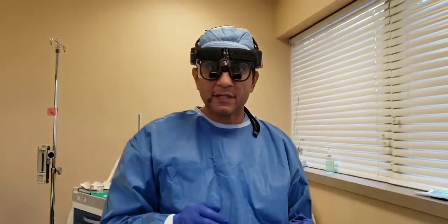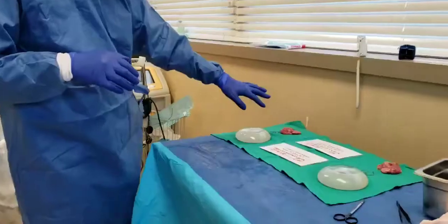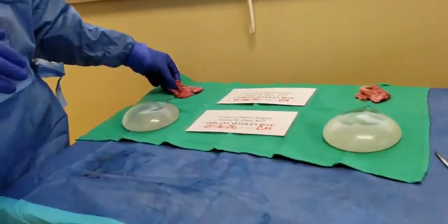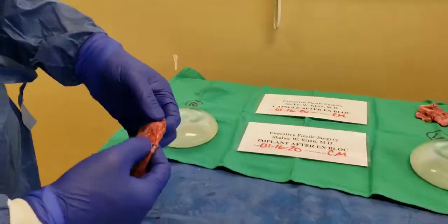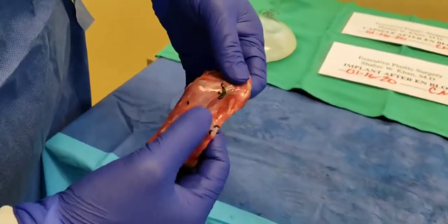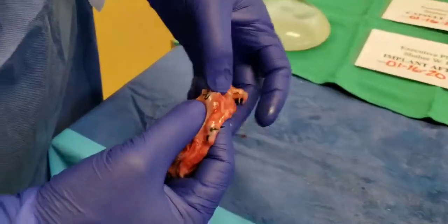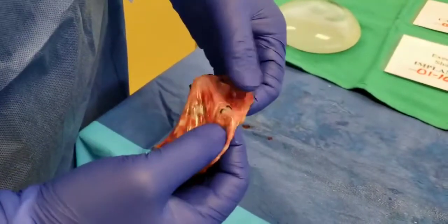She came to me with the classic signs of breast implant illness. I resected the capsule off. What I find interesting, as you will see, is there's a lot of suture that the previous surgeon left behind, and this is something I find abnormal.